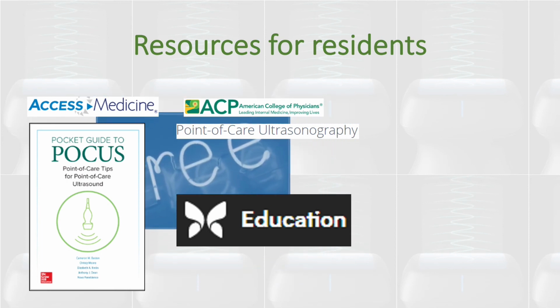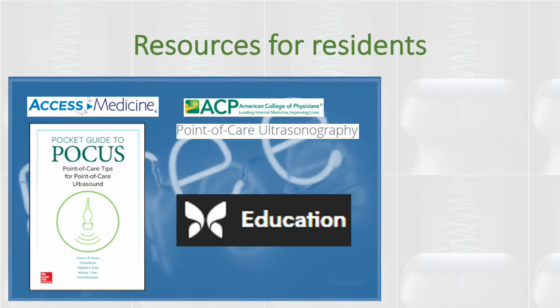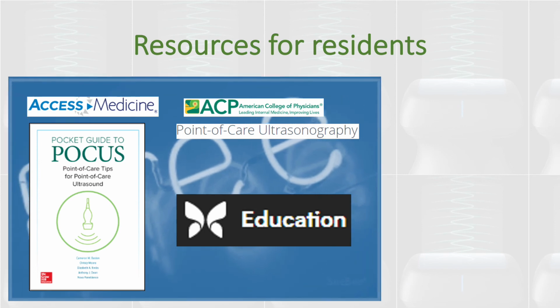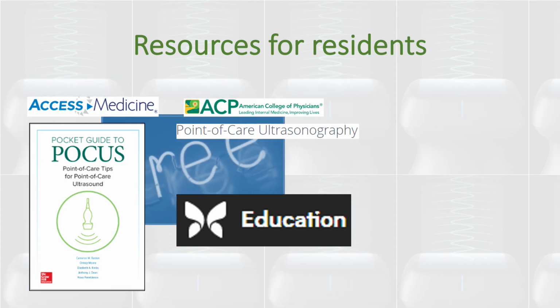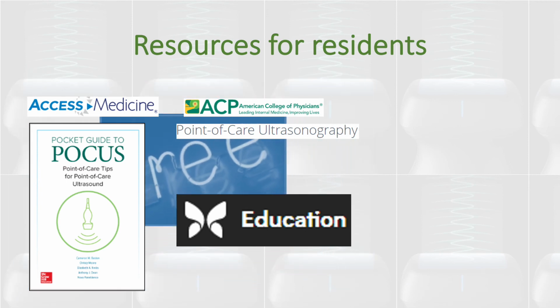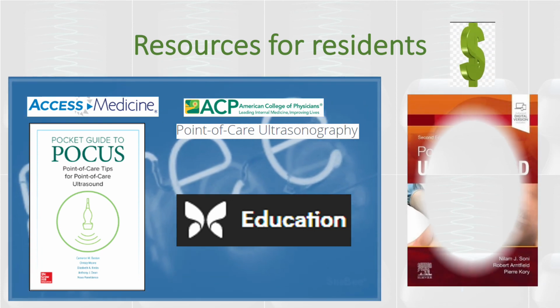And Butterfly did a good job creating a lot of short clips or videos for many POCUS examinations, and these are available on their website when you log in, or I think also in your device, so you can always look at those when you're doing your examination.